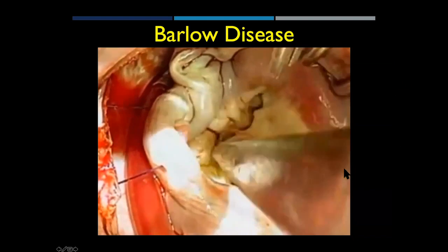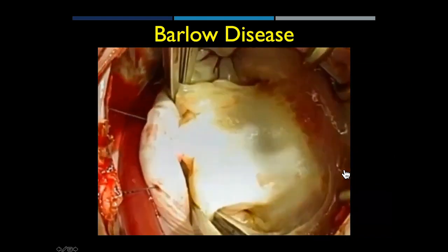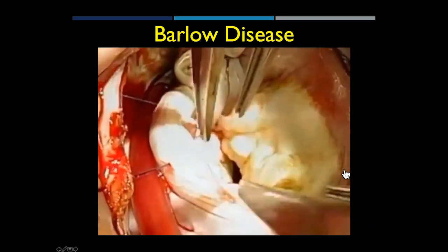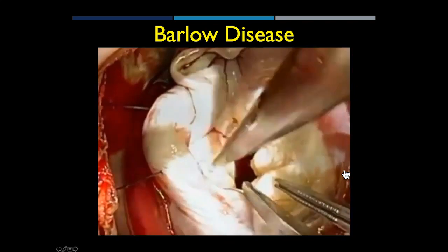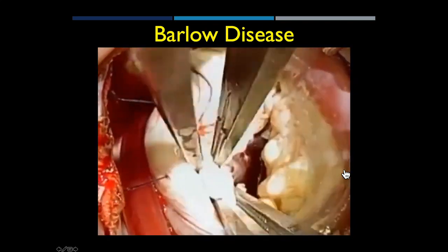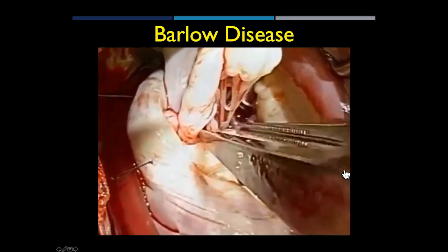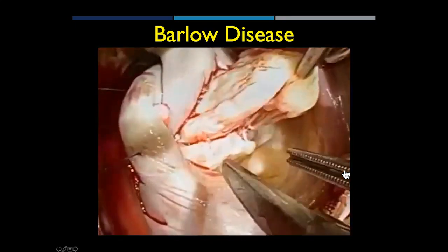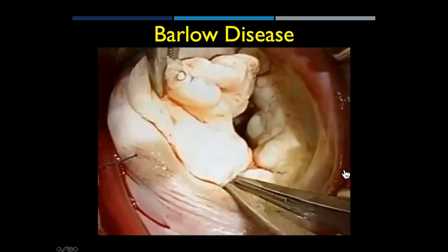This is actually an intraoperative view of what they could see in the OR. You can see the leaflets are huge. That's the anterior leaflet that was just pulled out there with excessive tissue. Now the surgeon's going to pull out the posterior leaflet. You can see the leaflet is giant, along with lots of thickening of the tissue, lots of redundant cords. This is Barlow disease.